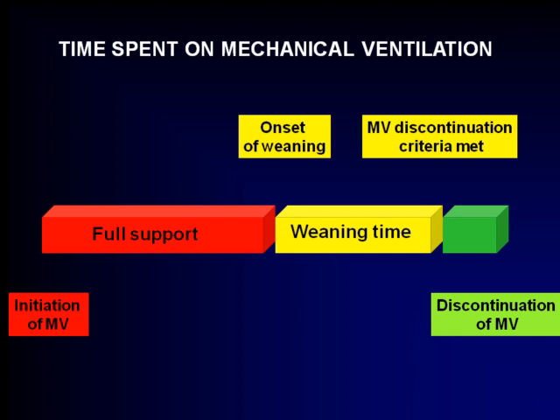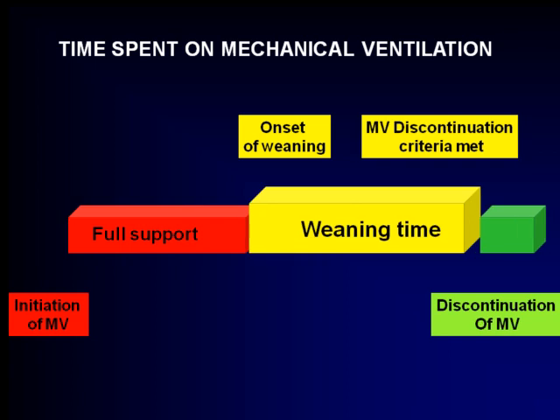What are the risks associated with patient-ventilator asynchrony, and why, in my opinion, despite the evidence not being so high, should we look for resynchronization? Traditionally, in the past, the time spent on mechanical ventilation was divided like this: a huge period of full support, then, when the patient was considered ready for weaning, a weaning time, quite long depending on the diagnosis, mainly for COPD, smaller for post-op patients, for instance. And when the discontinuation criteria were met, finally, after another small time, came the discontinuation. However, when you use assisted ventilation from the beginning, the description of the time spent on mechanical ventilation can look more like this, with a short period of full support and a longer weaning time.